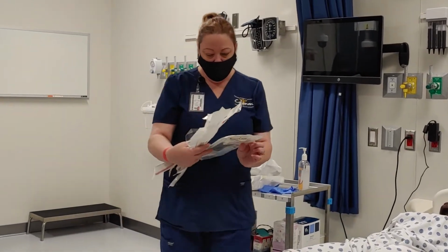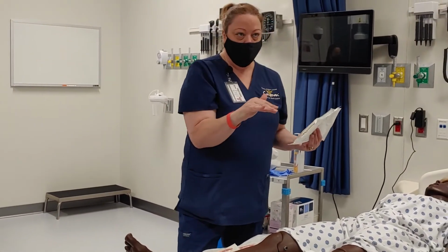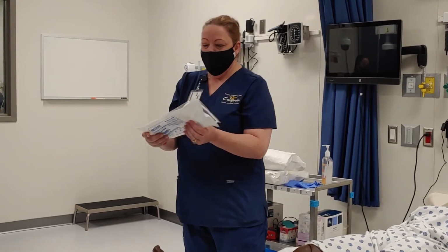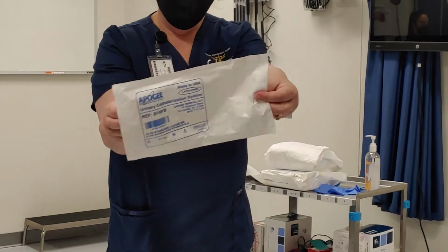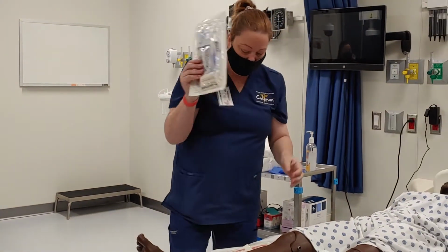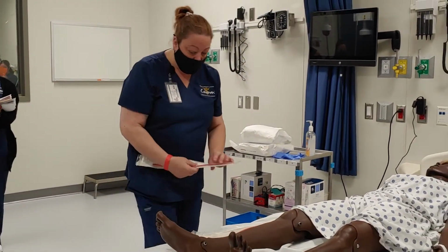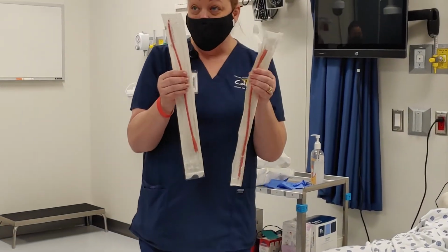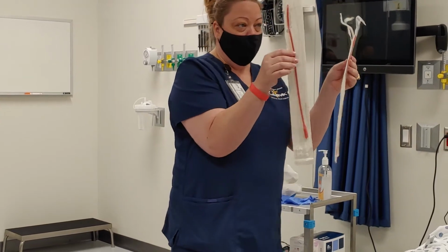So we talked about the straight catheter, which is one that does not stay in. We put it in, we drain the bladder, we take it out. I'm going to pass this around. This is a packet, okay, that contains the items that we need to do a straight catheterization. So we'll pass those around. You can also just simply use the actual urinary catheter, drain it directly into a cup or a basin, and that is what this is.